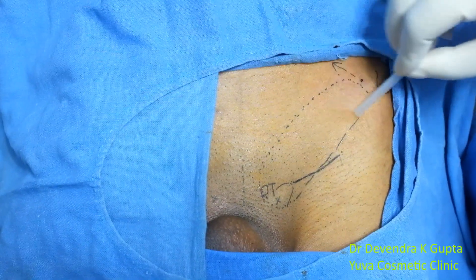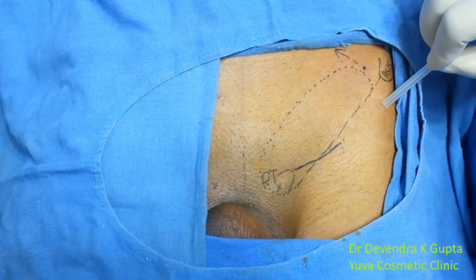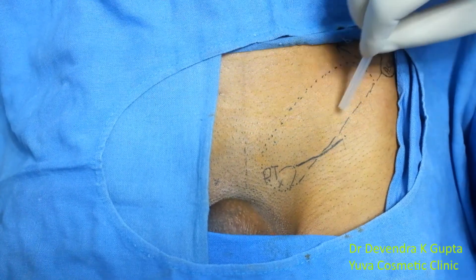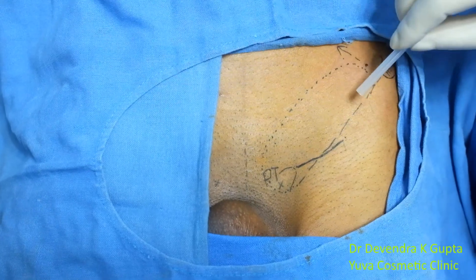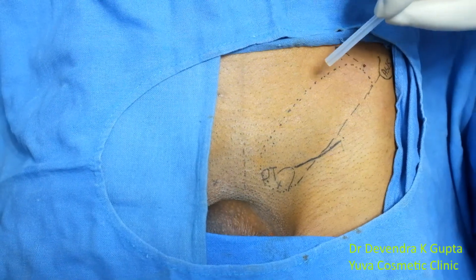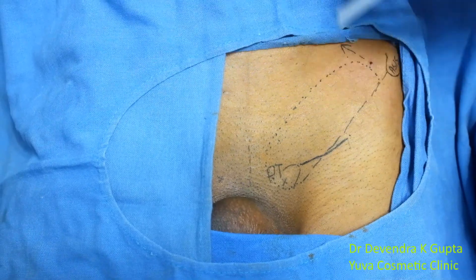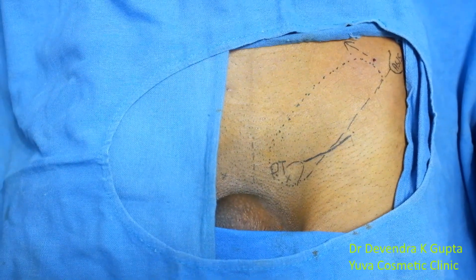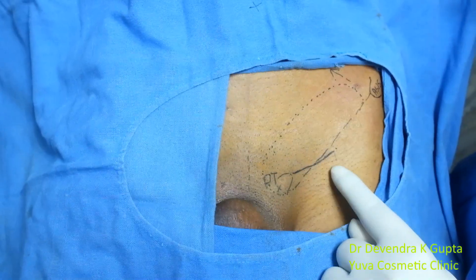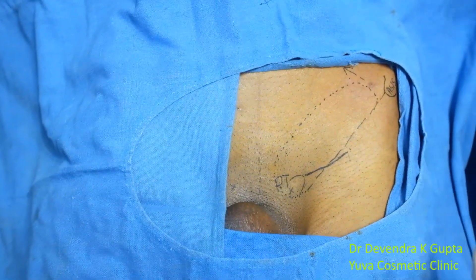This is the only area that gets anesthetized with the ilio-inguinal and ilio-hypogastric nerve block; the rest of the area is not anesthetized. I am now planning to give tumescent solution in this area to minimize bleeding. After exploration of the external oblique aponeurosis, I will inject the same tumescent solution around the spermatic cord to make the operation painless and comfortable for the patient.